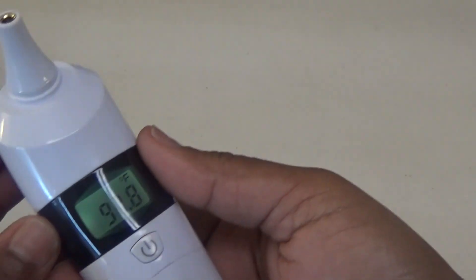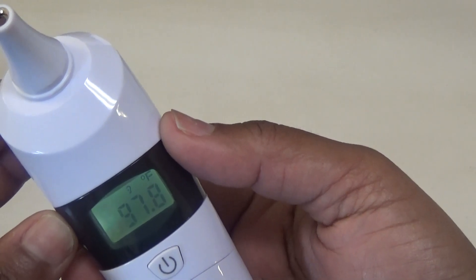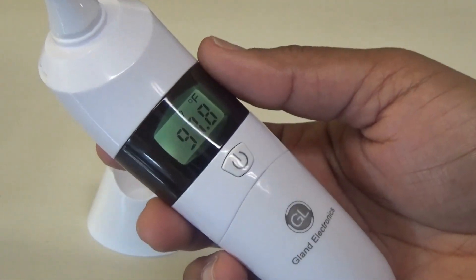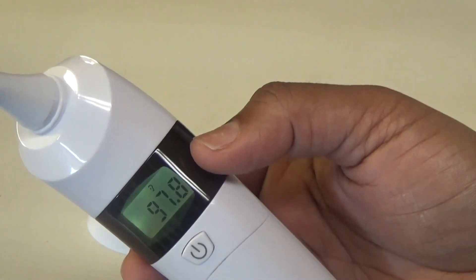And that's how fast you can get the reading. The reading is 97.8 degrees Fahrenheit. I love this. I love the accuracy of an ear thermometer.